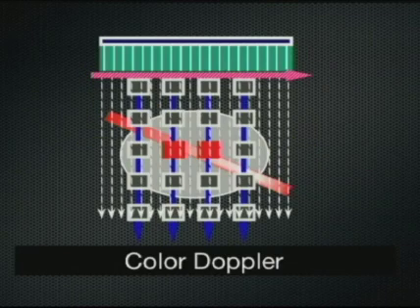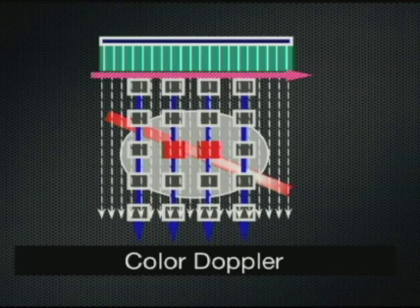With color Doppler, we're doing both of these things. We are sending from our transducer short ultrasound pulses, which are processed for their amplitude content to produce the grayscale image component of the Doppler color display, as well as sending longer pulses which collect Doppler information and allow both these components of the amplitude image information and the Doppler frequency shift information to be combined and displayed in the final image.